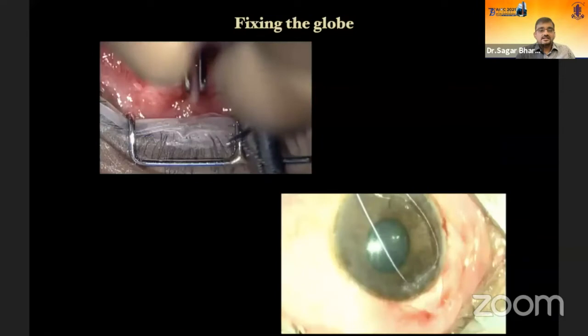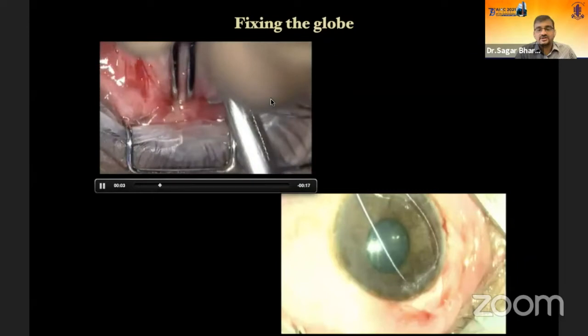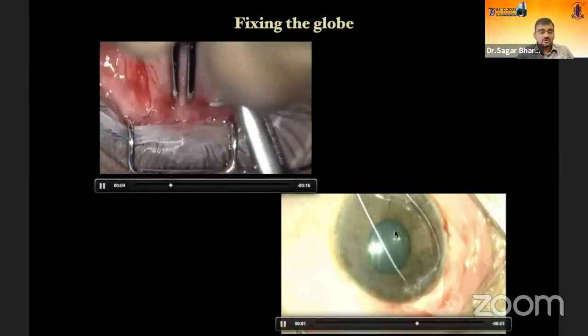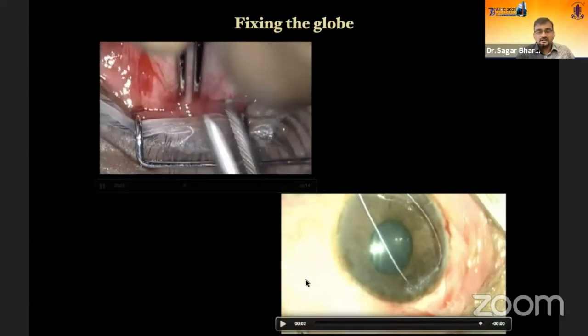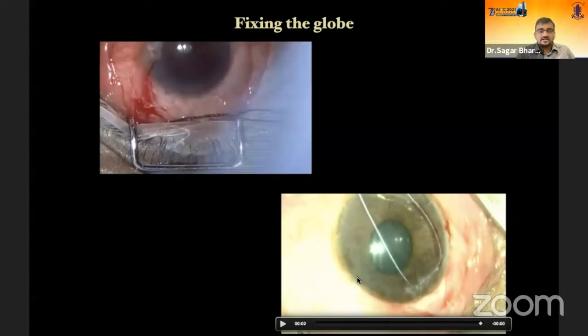This helps in rotation of the globe. I don't give it in the inferior quadrant because I want inferior rotation to happen for better exposure. For globe fixation, either you can use a superior rectus bridle suture, or place a 6-0 or 7-0 vicryl, nylon, or silk suture one millimeter anterior to the limbus and use it as traction.